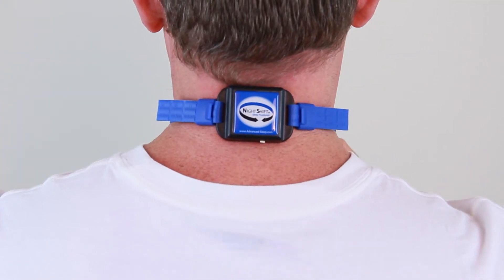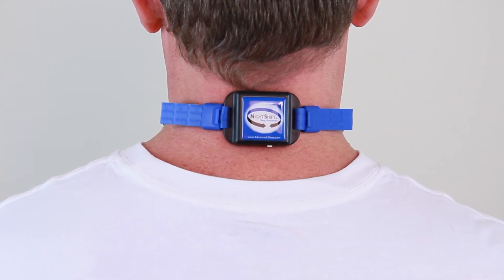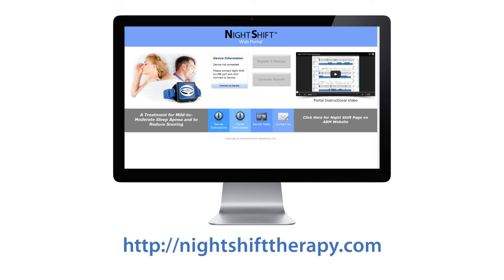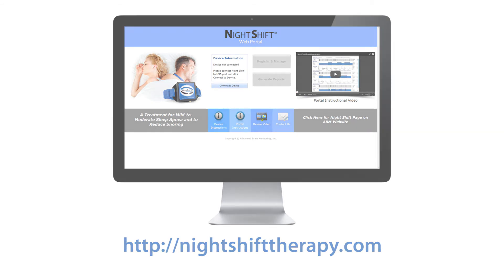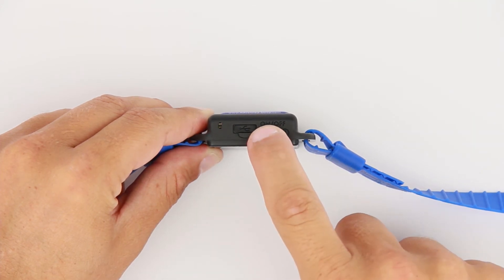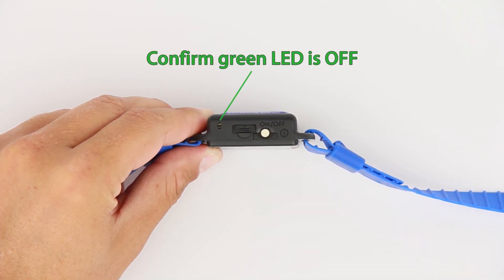You can now affix the Night Shift and go to sleep. Position feedback typically begins 15 minutes after it is turned on to provide you the opportunity to fall asleep on your back. This setting can be changed using the Night Shift portal. When you wake up, turn the device off by quick-pressing the on button and confirm the green LED is off.